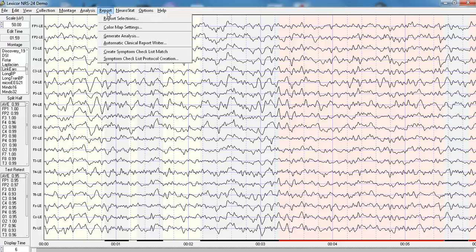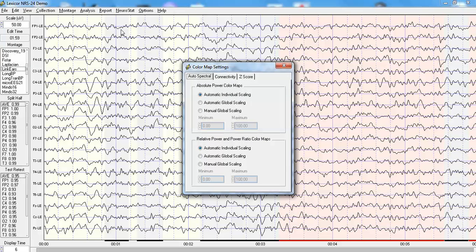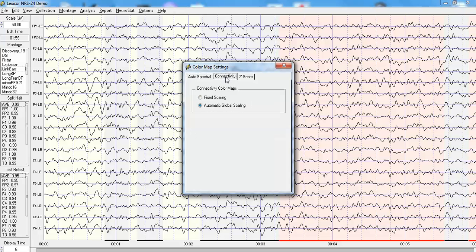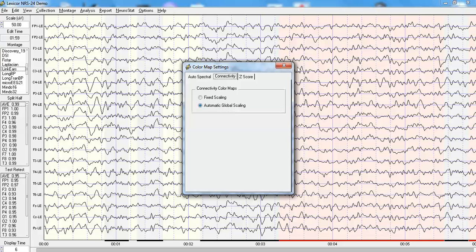Now, the way you begin this process is click Report, and then set the color map settings. When you click Report Color Map Settings, go to Connectivity, and select the Automatic Global Scaling. Do not use Fixed Scaling, because then it will be fixed at plus or minus 100. You won't see the fine details. So, we've selected Automatic Global Scaling.